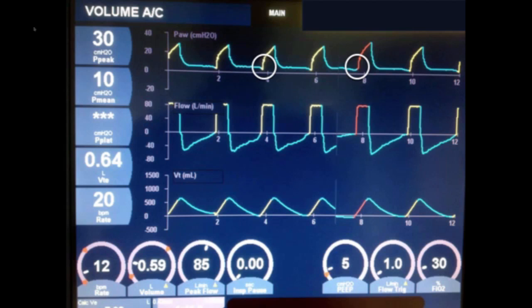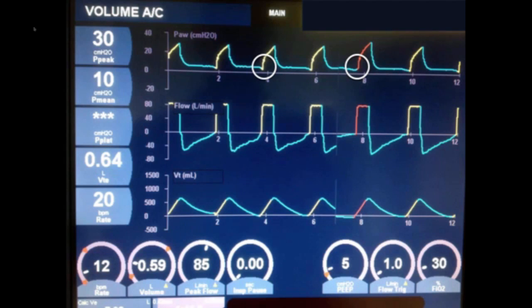In contrast, the breath noted in red over by the number 8 in the top line shows no negative deflection — the ventilator has given a controlled breath. The patient did not initiate a breath, but received a tidal volume of roughly 600 mLs.